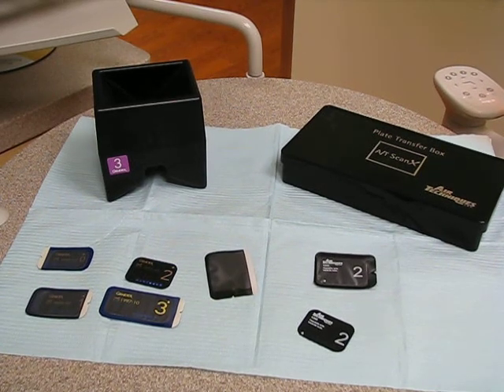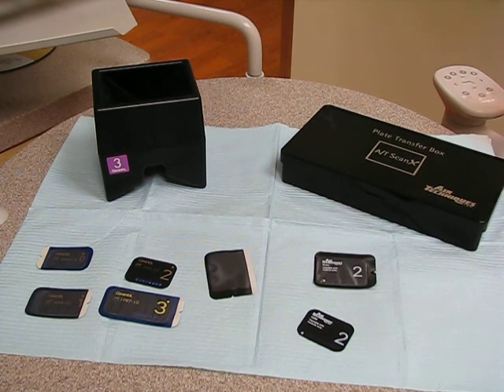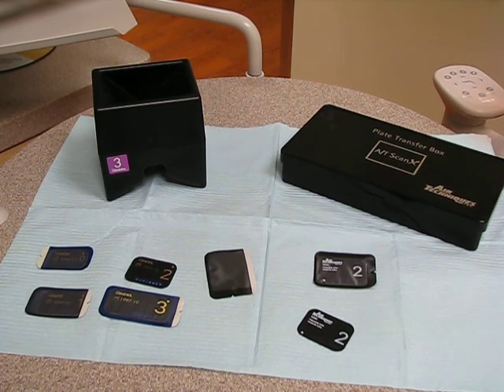Today we're going to be demoing how to use digital imaging using the ScanX sensors. This would be the indirect or wireless digital imaging. Remember that indirect means that you have to take your sensor once you've captured your image and scan it to the computer — so indirect or wireless.